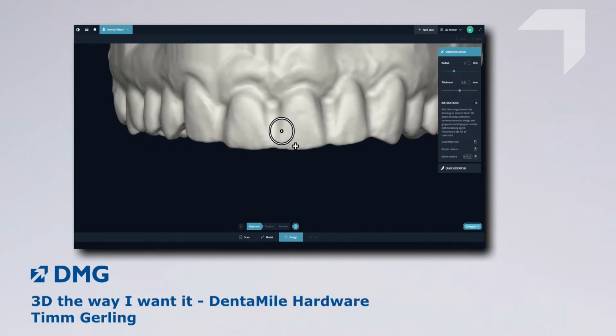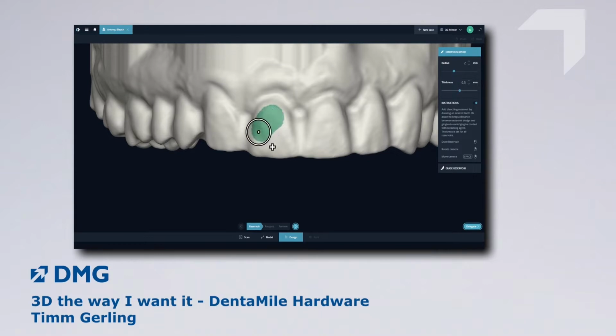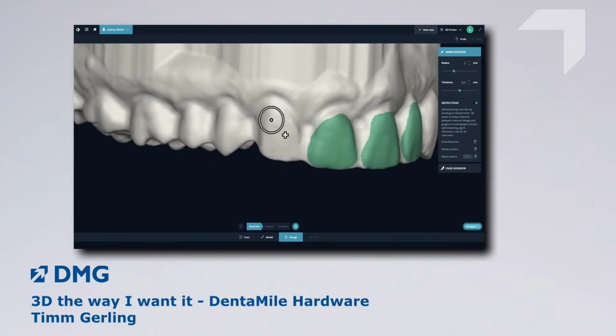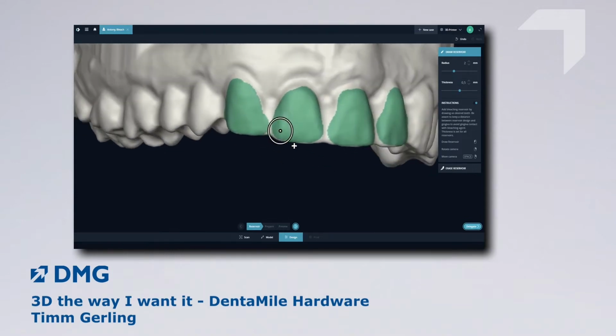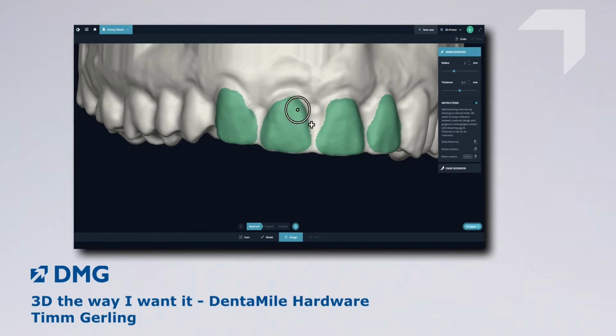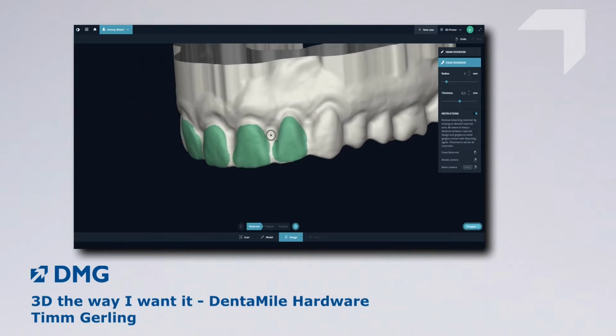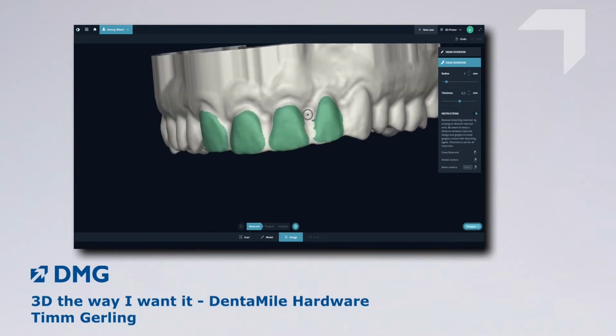So then we zoom into the jaw, and I will create a bleaching reservoir on the front teeth. On the 4 front teeth. And here. And also on this one. And when I'm not really satisfied with the design, or accidentally hit the gingiva area, I can use the erasing tool and remove the parts of the reservoir that I actually do not want to have. Okay, so when I'm satisfied with my reservoirs, I go into the next step.